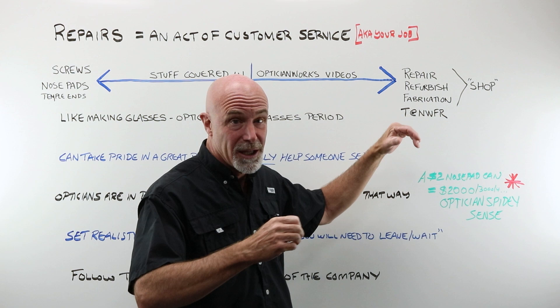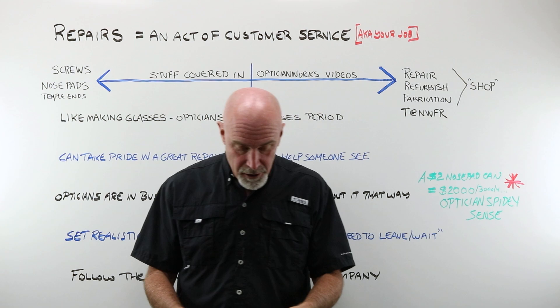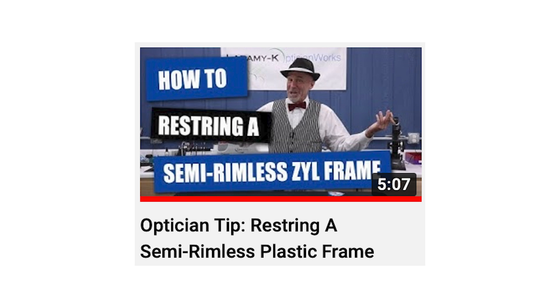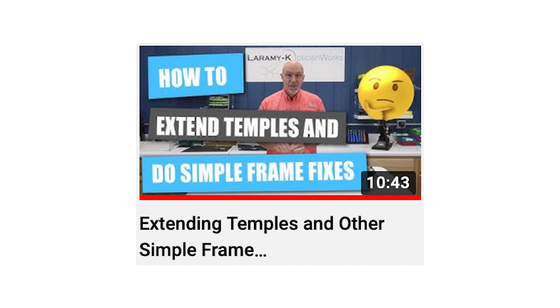Now, everybody else is going to fall somewhere in between, and we have got you covered. Other videos show you how to use the screw extractor, do epoxy glue repairs, how to restring a plastic semi-rimless frame, how to do a spring hinge fix — a temporary one. We cover all about nose pads, figure eight liner, how to rebuild a three-piece mount, how to restring semi-rimless, extending temples, resizing a lens, customizing a pair for a helmet, and lens washer.